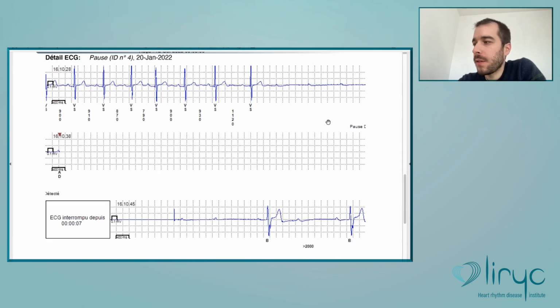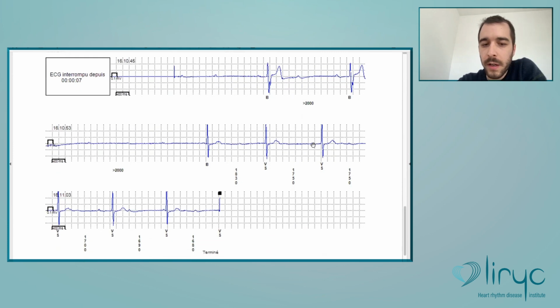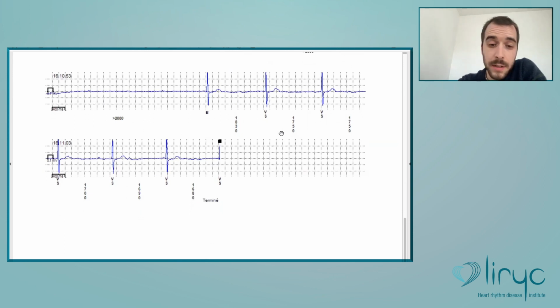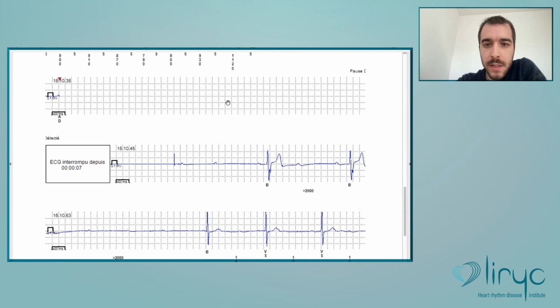All right. So on the tracing, we see at first clearly normal sinus rhythm, 1 P wave before every QRS, and then here 1, 2, 3. You see the EKG was interrupted here, and then you have another block P wave here, and then 2 to 1 AV block. So this is a high-grade AV block, 2 to 1 AV block. So the patient clearly had a pacemaker at follow-up. So once again, not very complicated tracing.